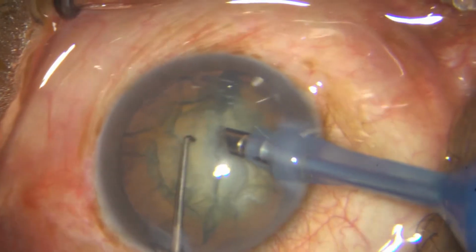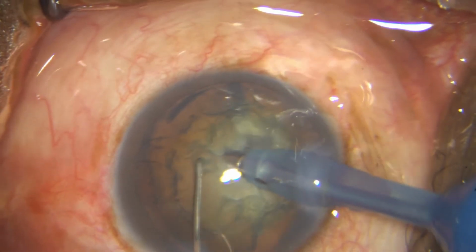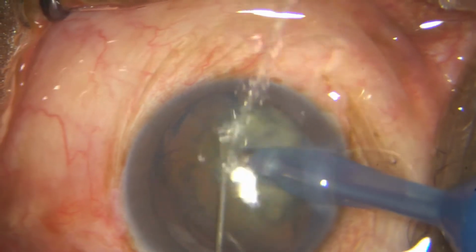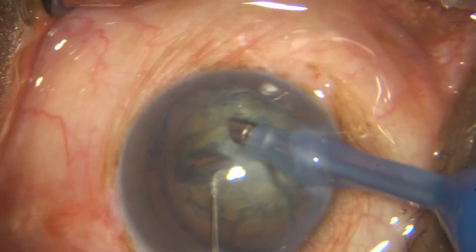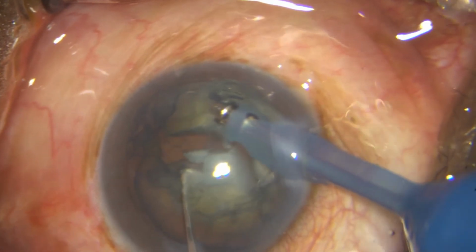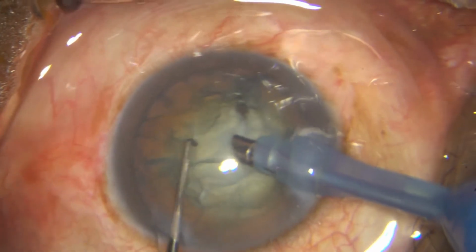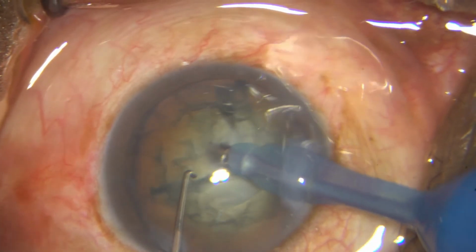So just rotate. Very important that you finish off all the steps in one go. Don't keep coming out of the chamber. If the nucleus gives way, you can catch it in another area and complete your chop, as I did there.